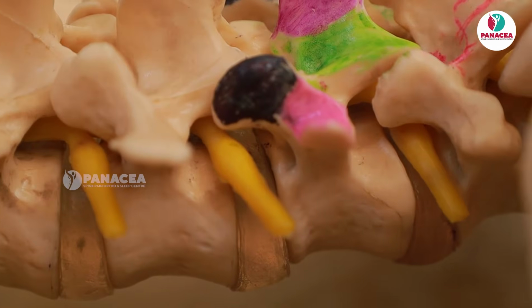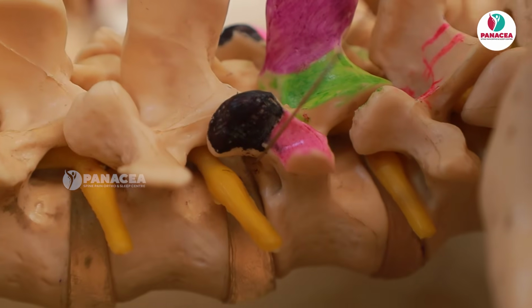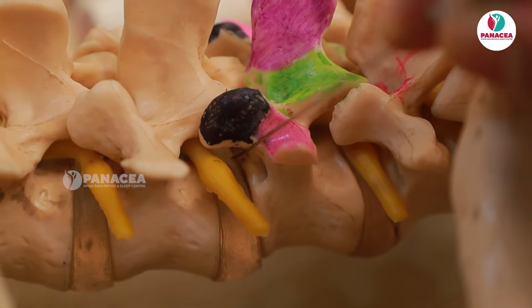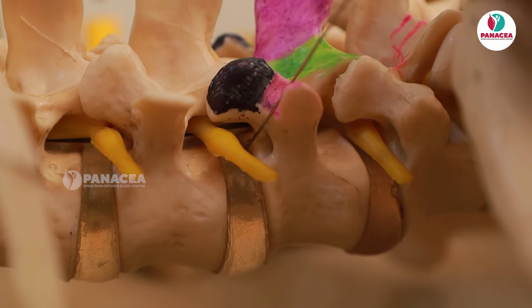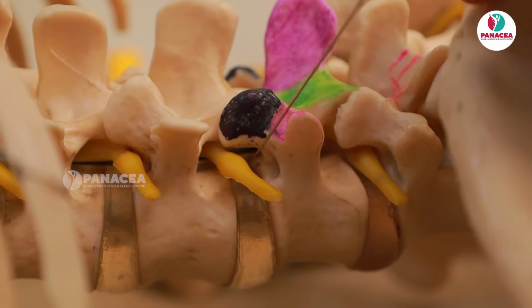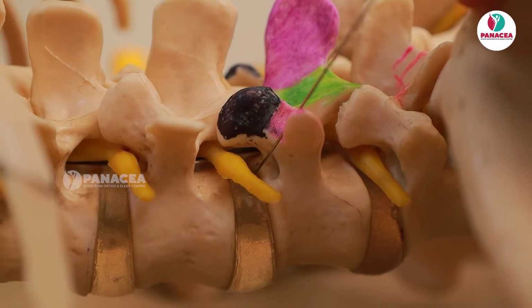So in Kambin's approach, what you do is you go almost on the lateral aspect of the and slip into the intervertebral foramina, exactly just posterior to the disc herniation, so that you are addressing the pathology as well as the nerve irritation also. So both things are addressed in transforaminal epidural.